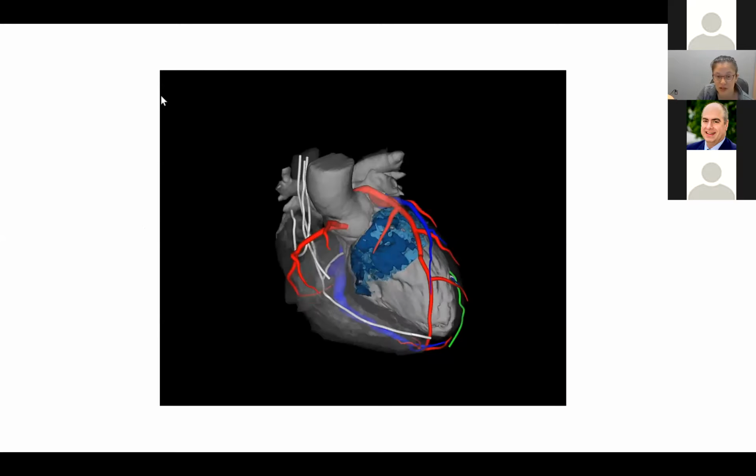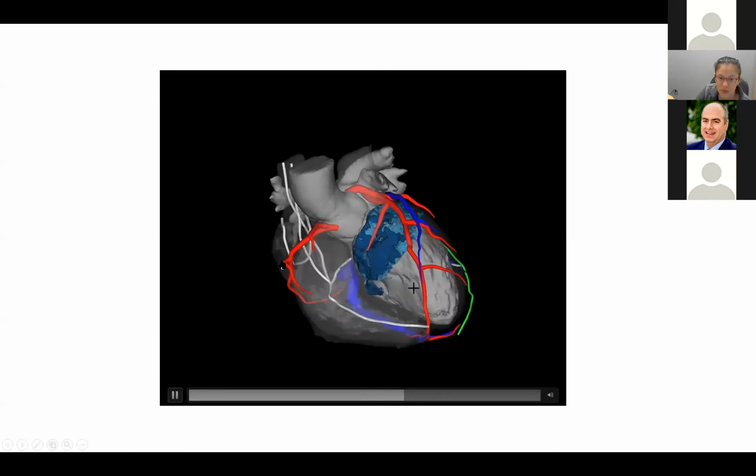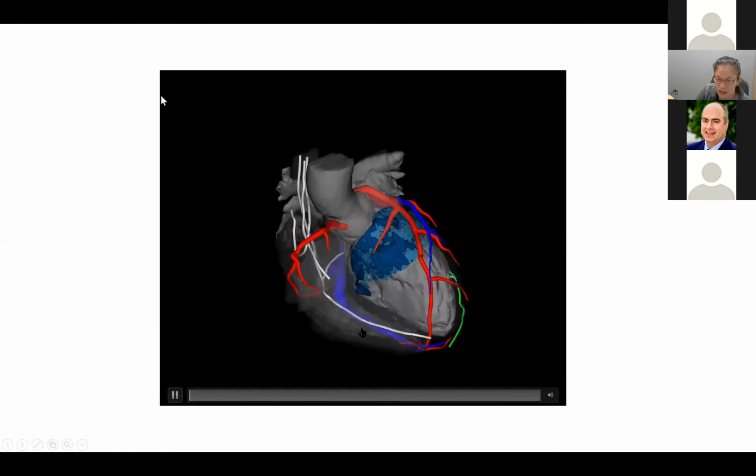And for this patient, we did a cardiac CT. So these are images from a gated cardiac CT with delayed enhancement images. And the reconstruction was done as part of a collaboration with the Bordeaux group. And you can see a lot of different things on this scan. You can see the parts of the ICD. Certainly you can see the atrial lead, the right ventricular lead, and the CS lead going off behind there. You can see the coronary arteries.